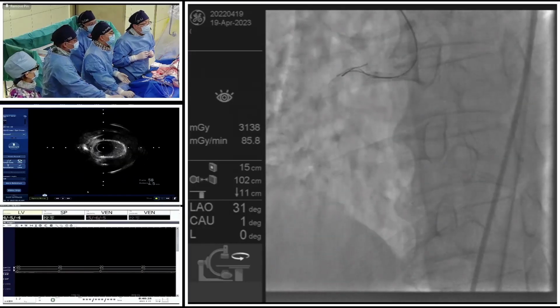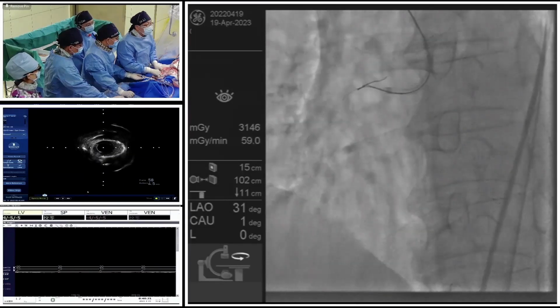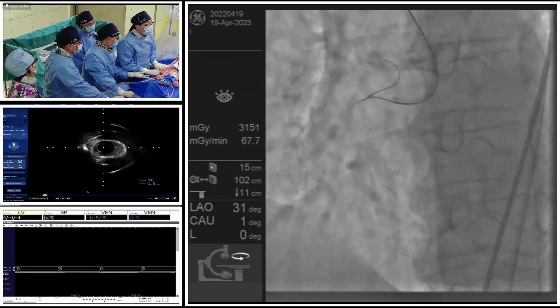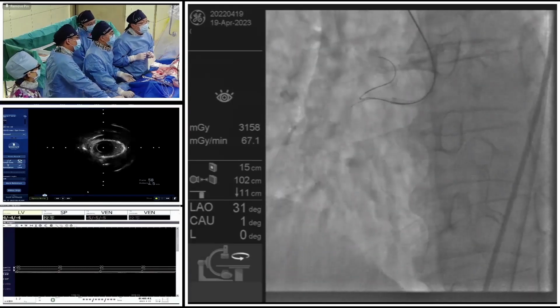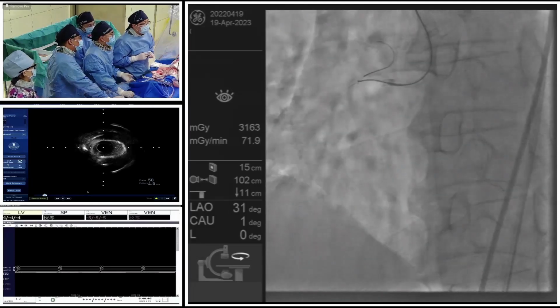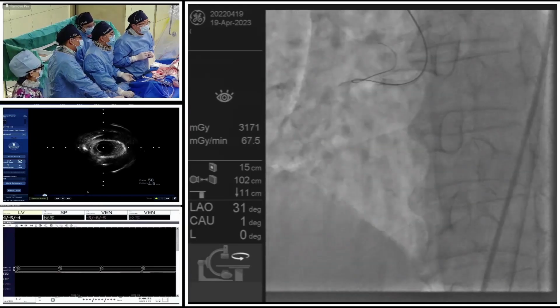Especially for the CTO segment. In a lot of CTOs, especially after instant recanalization following a long time of occlusion, vessel shrinkage and spasm happen, which creates very high resistance. So the instant stenting strategy might not be a good choice. DCB use in CTO procedures for long, diffuse and small vessels could be another choice.